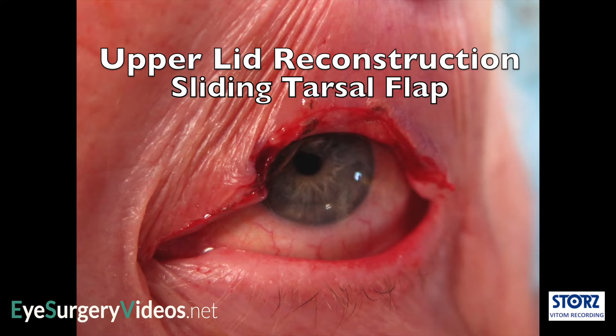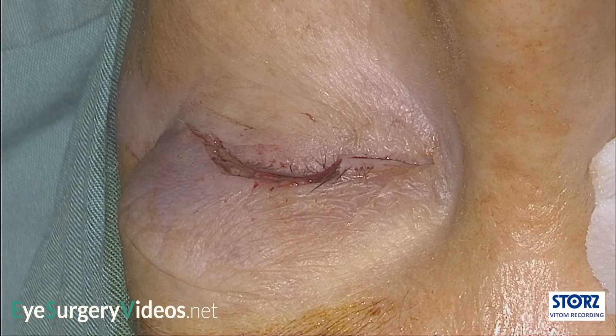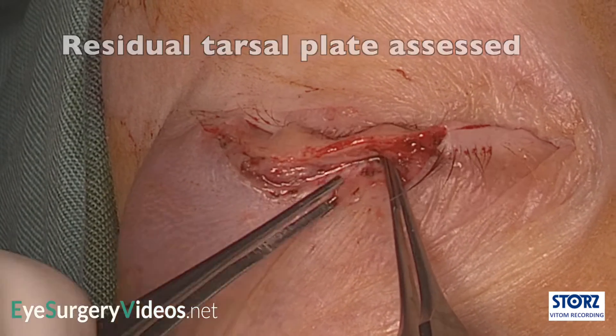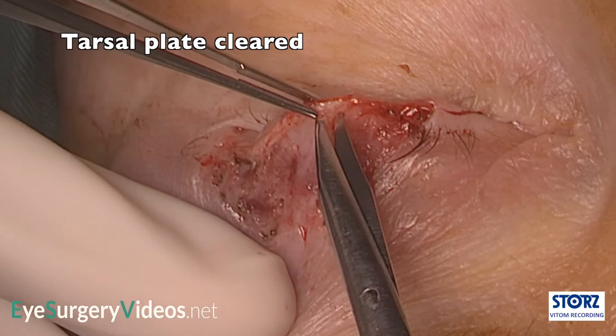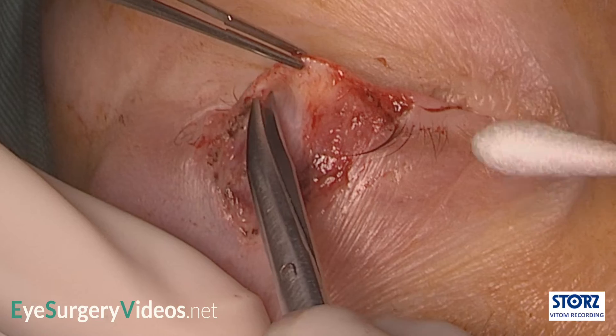Residual superior upper lid tarsus can be slid into an upper lid defect to reconstruct the posterior lamella. Around 50% of the upper lid has been excised in this case. However, when the lid is averted and the tarsus assessed, there is around 4 or 5 mm of residual tarsus superior to the defect. This can be advanced in a similar fashion to a Hughes flap to the lower lid, but into the upper lid defect.